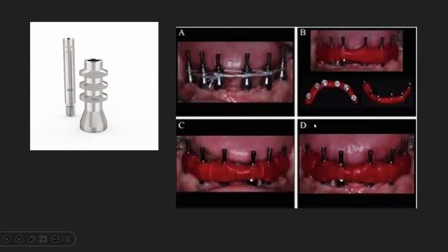Another example for ensuring that you will always have angles is the prosthetic part for the multi-unit. You will always find the open tray impression technique for the multi-unit and will not find the closed technique, or rarely find a closed technique, because the companies have advisors that tell them that with multi-unit you will always have angles. So closed tray is not needed with multi-unit restoration. Many companies neglect manufacturing closed tray impression posts for multi-unit. They only manufacture an open tray for their multi-unit impression techniques.